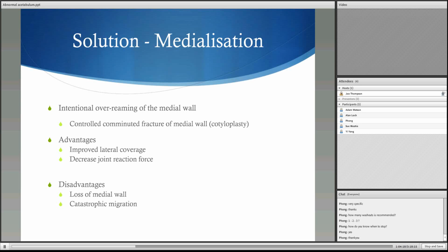Fit, and you can use localized bone. Very thin polyethylene wore out. But with better bearing material, you can use a bigger diameter.